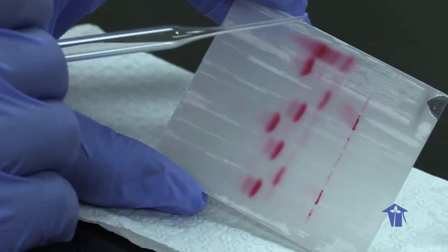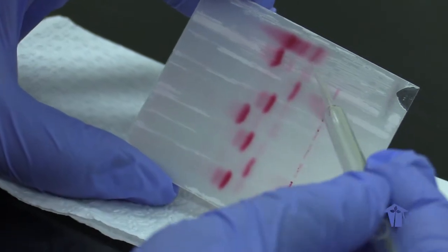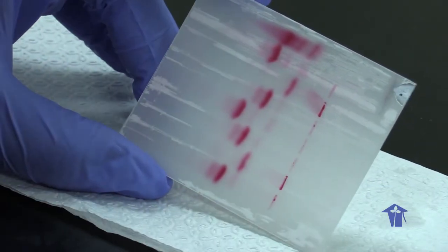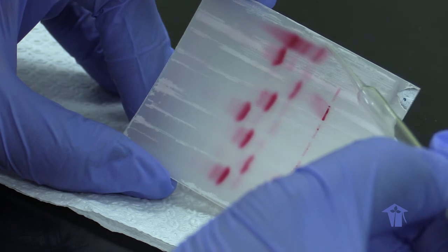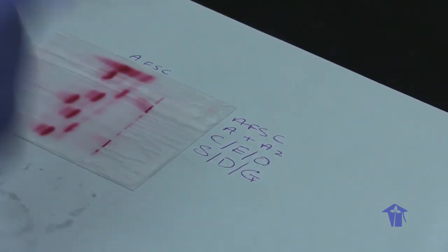We can still see our control bands, which is in first position, and we can see where our sample bands migrated to. So remember, I told you before that your control bands are A, F, S, and C. Okay, so we have our control band on top, our reference band, AFSC, which is AFSC here, and we read our sample against the control sample.